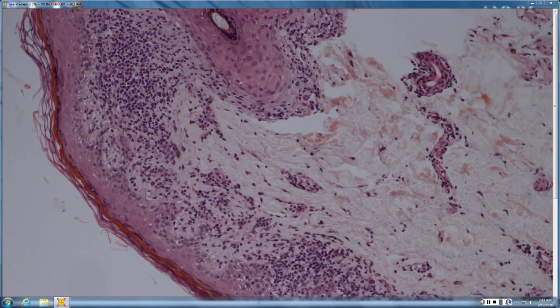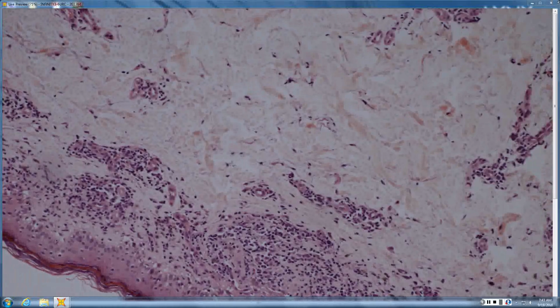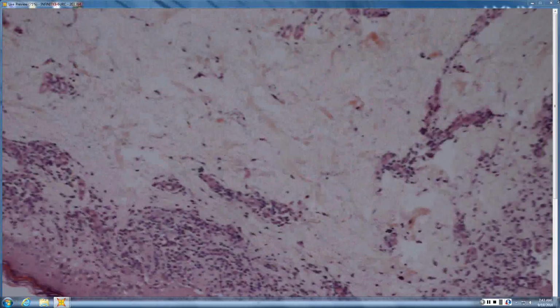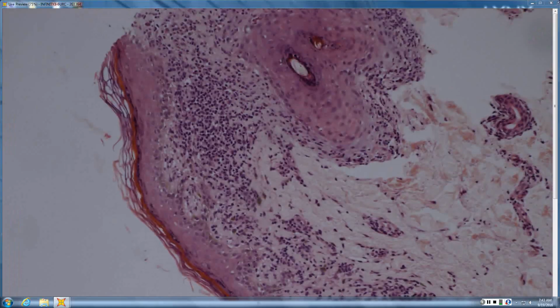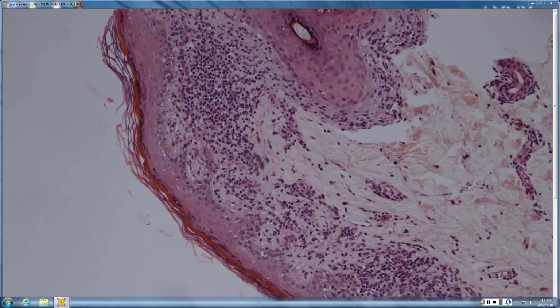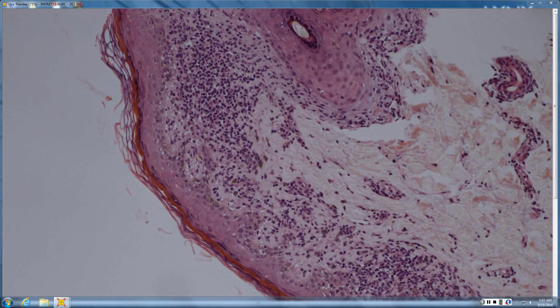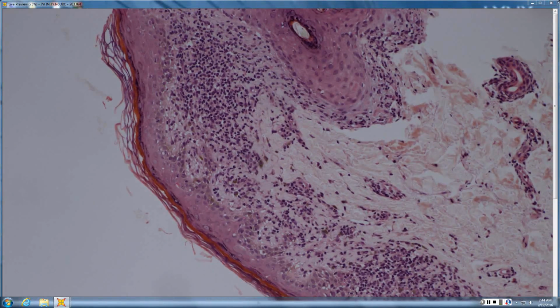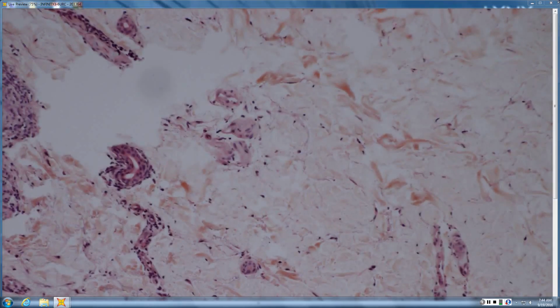Lichenoid interface. Thick band along the junction there, and some adnexal involvement too. Okay. And we're looking at the corneum. The corneum's sort of subacute. Sure. With about half the corneum being red, this lesion's been around probably about 2 weeks or so. It takes about a month for the full corneum to turn over, although it varies a little bit by body site.